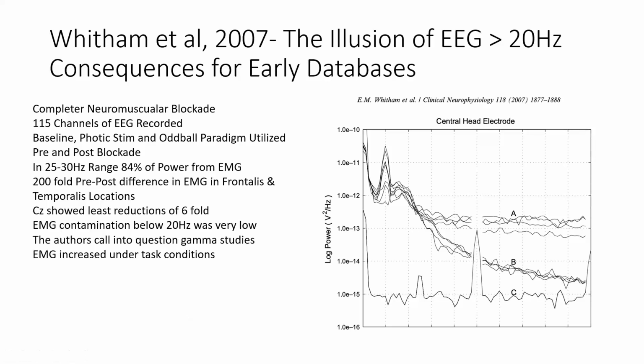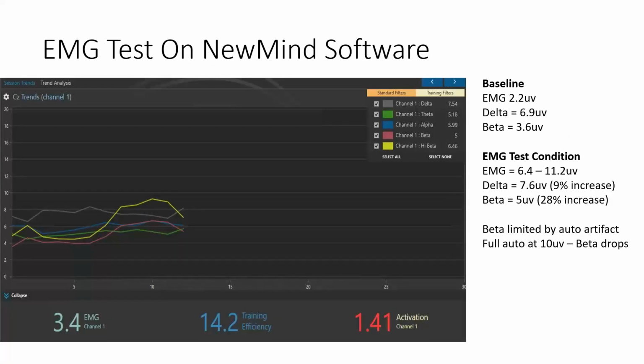EMG increased under task conditions. Whitham found the same thing. Well, that would completely confuse you if you didn't know that, and you thought you were getting EEG, particularly with our grade equipment. I mean, come on. We're not using laboratory grade equipment and software. I mean, not the kind that they use for really high level research.